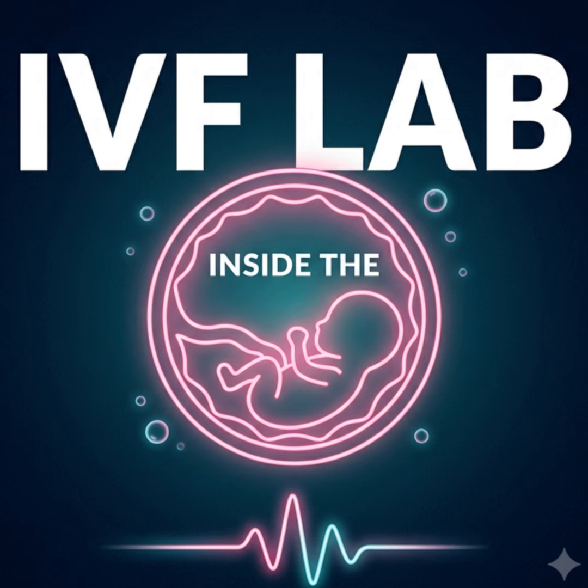And this raises a highly important point about how we process this information. We have to be incredibly careful not to panic at every single tiny deviation on the timeline. The interpretation of these morphokinetic events is extraordinarily complex. Not every detected abnormality has the same lethal clinical significance. Right, because we are dealing with biology, not a microchip. Biology is inherently messy. It makes mistakes and fixes them.